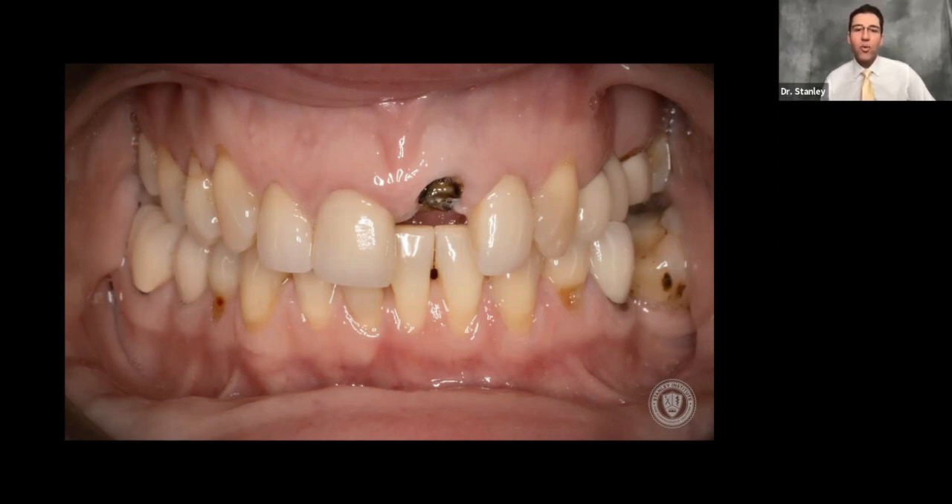So here's our starting point — it's broken off at the gum line. We do a prosthodontic-driven protocol, so we're going to take two things: a 3D scan and an optical scan. It doesn't matter what product you use — you just need those two things. We merge them together in a software package; in our case we use the Three-Shape product. From the case, we get a guide that will help ensure that we put the implant in the right location.